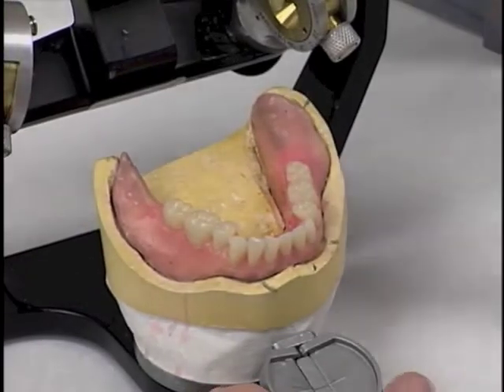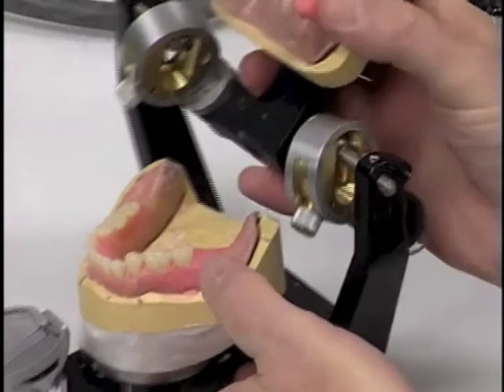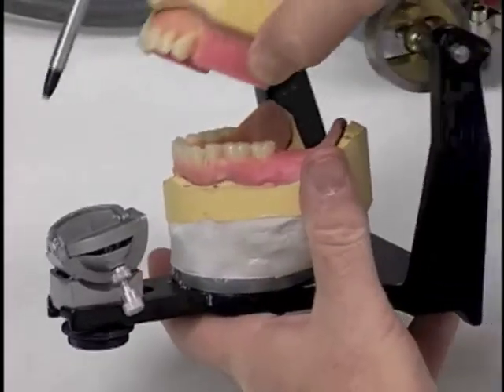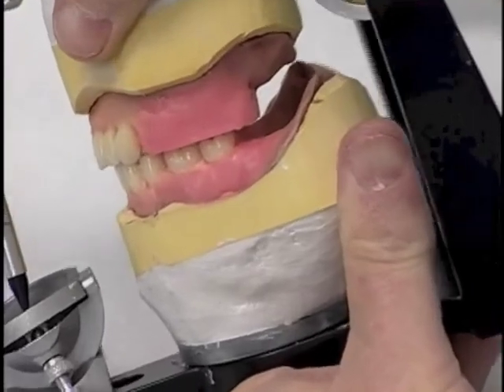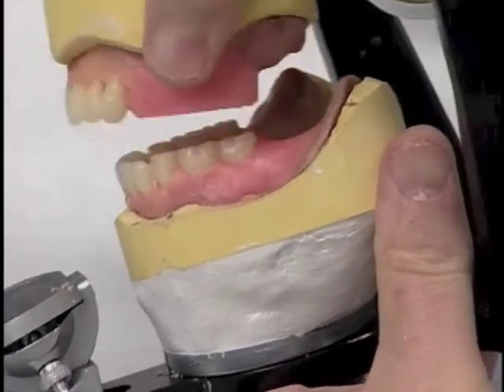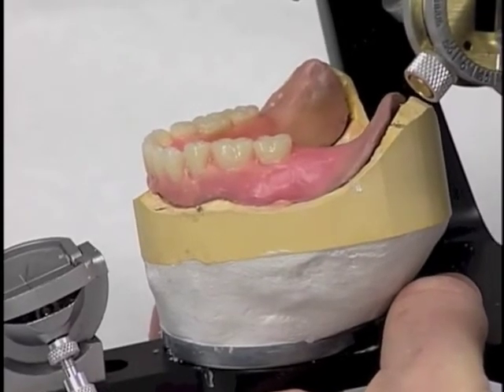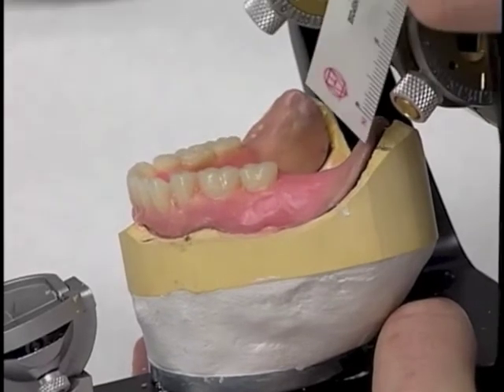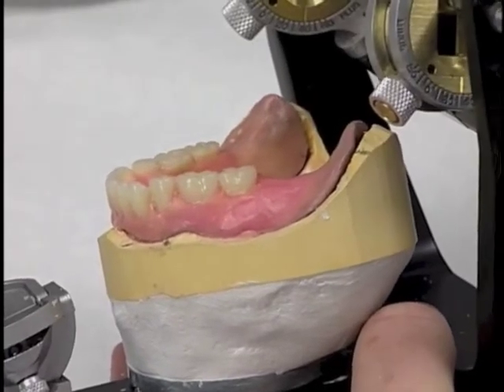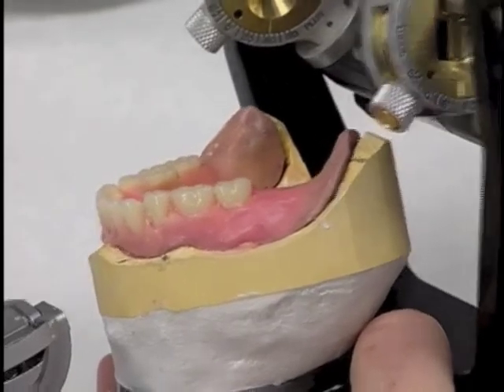The next thing that we would like to observe would be the occlusal plane, in that if we close the articulator and we see that the occlusal plane is where we wanted it to be, and that it starts with the tip of the canine and is a straight line back to about 2/3 of the way up the retromolar pad, and that appears to be where we are. So that part of it looks good.